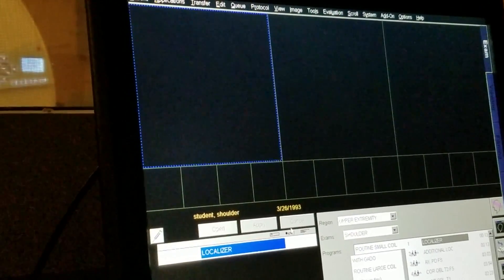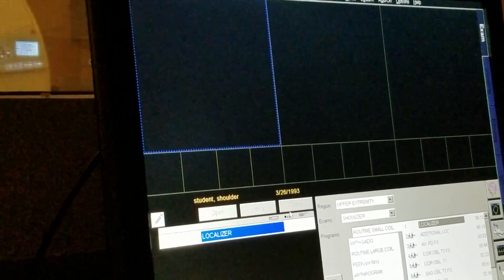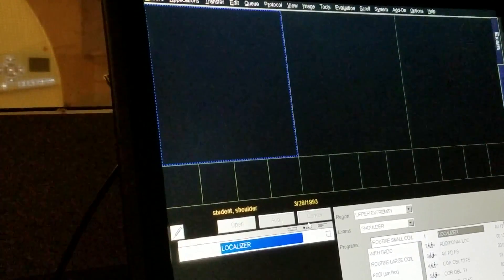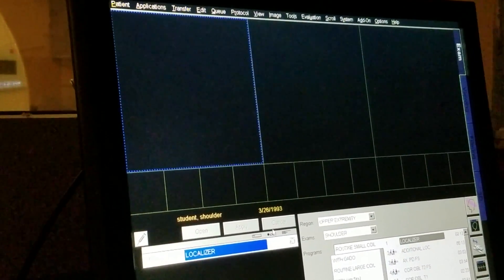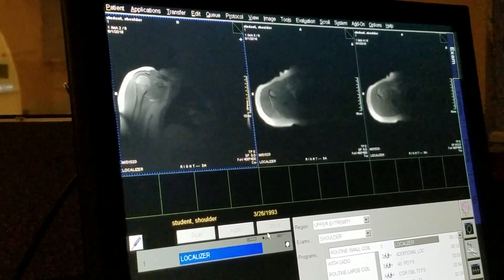I can't stress enough to you that for every extremity you scan — I don't care if it's a knee, a shoulder, a finger, a femur, it doesn't matter — any extremity you scan: localize, localize, localize. Keep localizing until you have the best imaging planes you can have to start positioning your true scans.